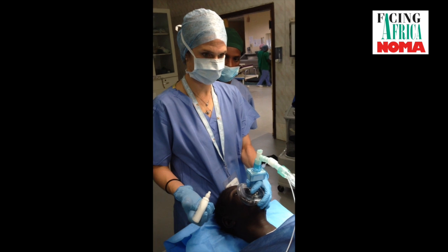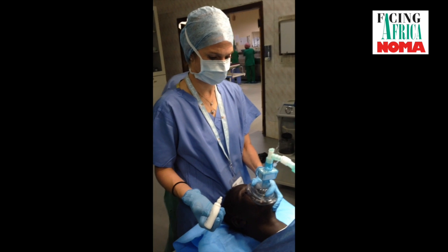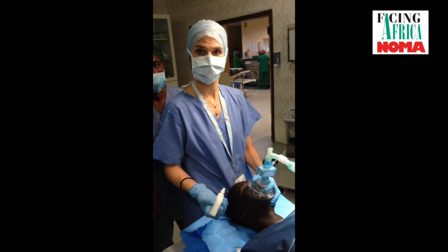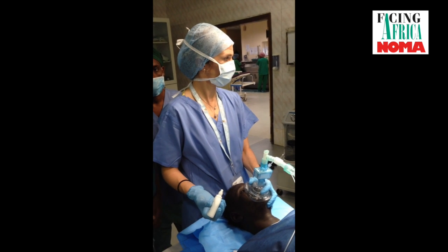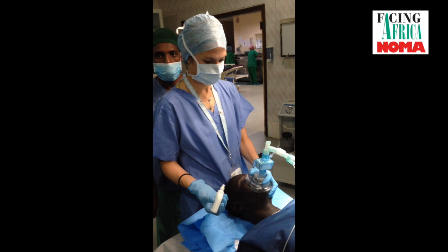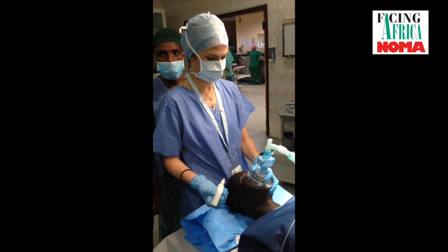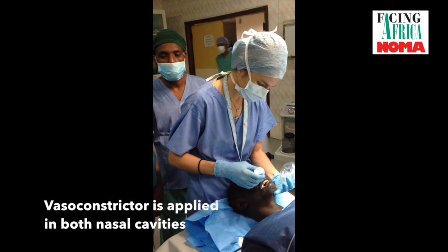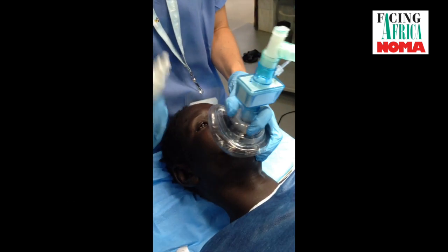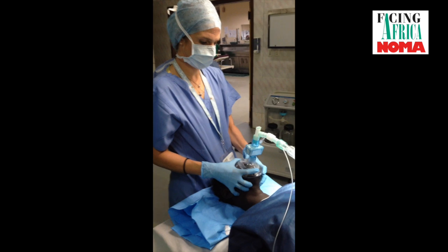A patient having a nasal fibre optic intubation for a trismus release. This is not an anticipated difficult airway, either from the point of view of mask ventilation or from intubation. The patient's able to open their mouth widely, and we would be able to access with conventional techniques. So we're under general anaesthesia, paralysed and anaesthetized, and we're going to prepare the nose at this point with a vasoconstrictor, this is Otrivine, probably preparing both nostrils, both of which are patent, are they not, Alice? Yes. Okay, so we'll give that a few seconds to take effect.